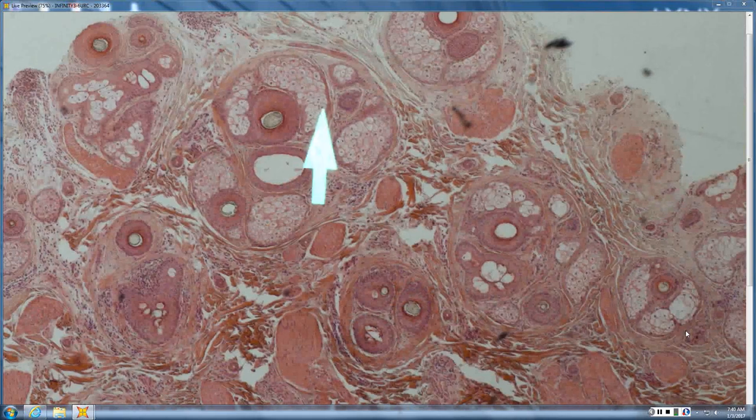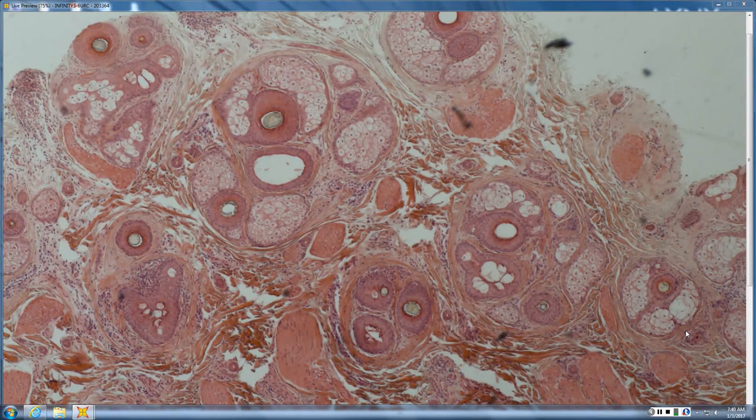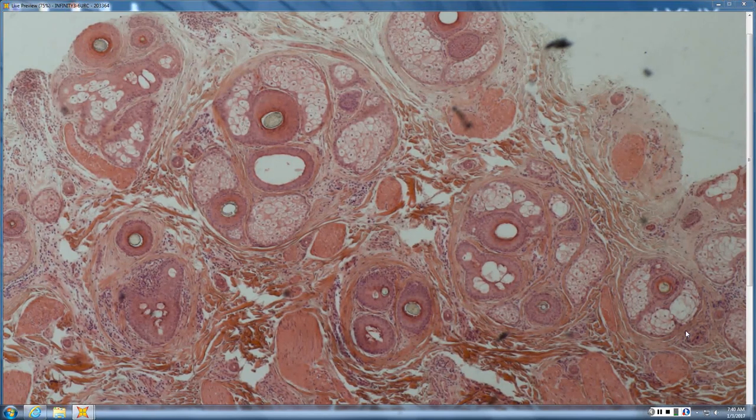And then there's a lot of sebaceous glands, which goes with pattern. They're certainly lost as a very early finding in scarring alopecia, and here they're not lost; they're preserved. There is some inflammation high, at a level around the infundibulum. That's common in pattern alopecia. It's probably just sebderm, seborrheic folliculitis. So I think you're right. Best diagnosis here would be just pattern alopecia.